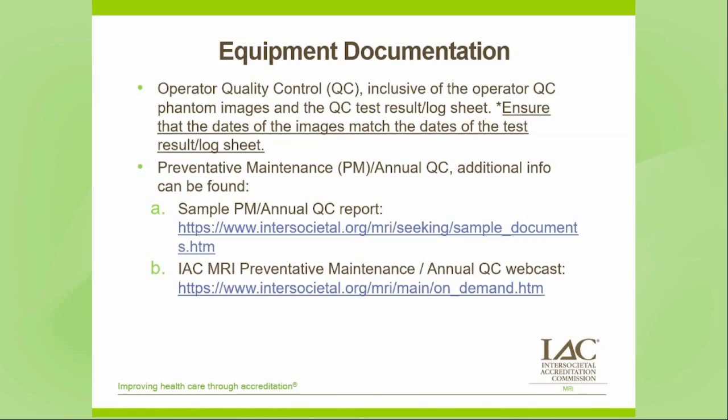Or sometimes the report doesn't have the identifying characteristics that are necessary to confirm that the report is for the pertinent MRI unit, which must include the address of the unit, the manufacturer, and the serial number. Other common oversights regarding the PM annual surveys are the omission of follow-up maintenance records when the engineers or physicists identify a deficiency.